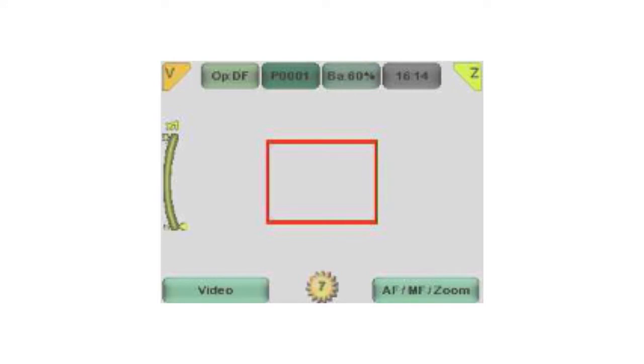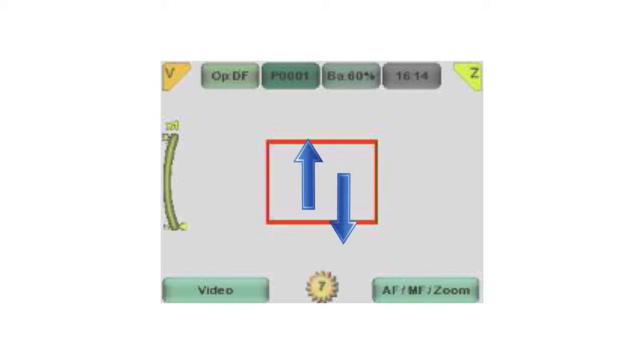There are 4 different zoom levels: 1x resolution, 2x, 4x, and 6x resolution. You can zoom in and out by pressing the up and down arrow keys. The icon on the left of the screen will indicate the zoom level.